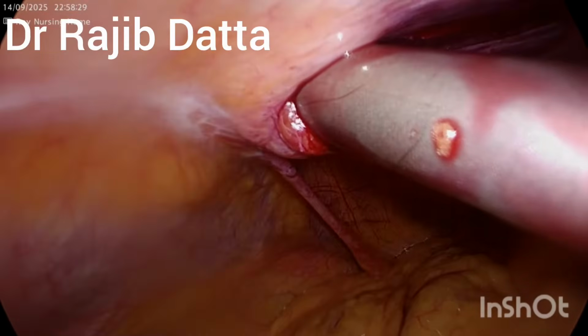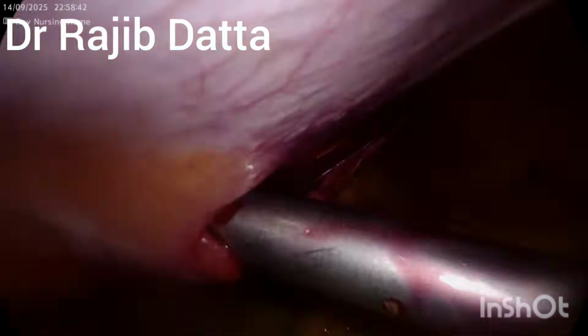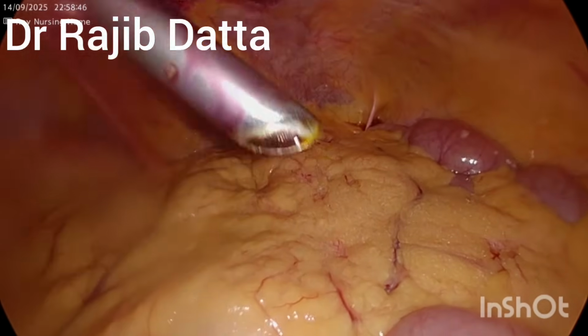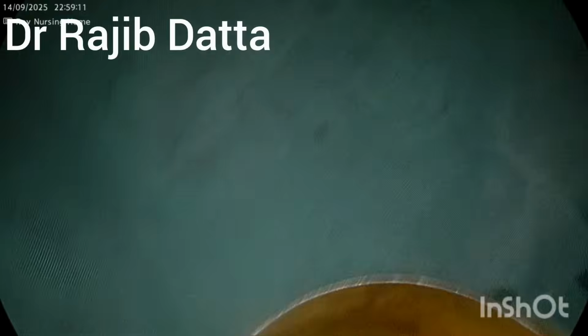Now the port has been reintroduced for proper thorough peritoneal lavage, which is the main key for early patient mobilization as per the ERAS protocol. So thorough peritoneal lavage is going on.